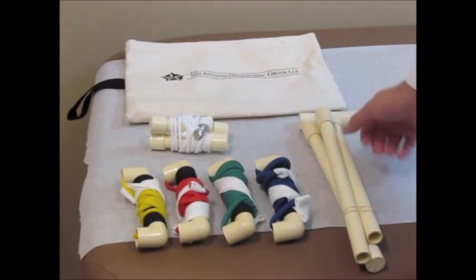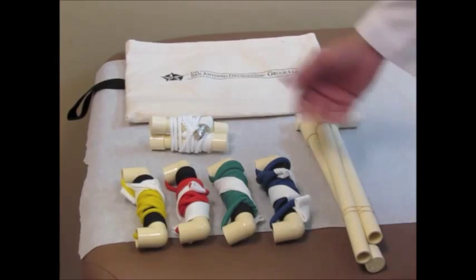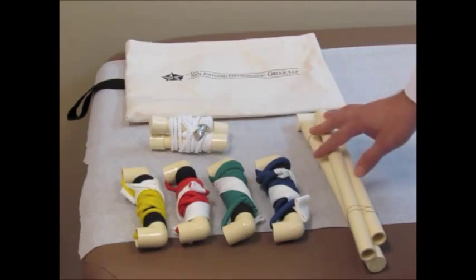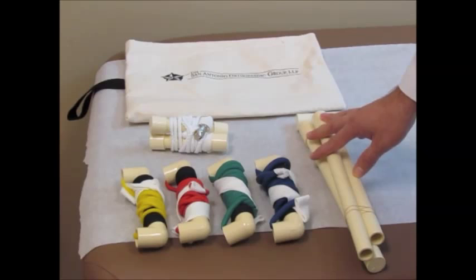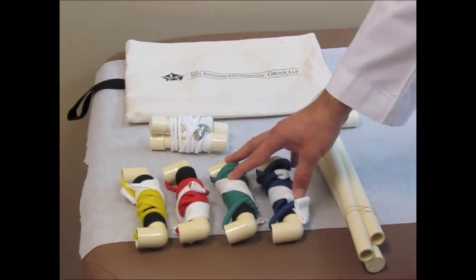Here we have the Physical Therapy Shoulder Kit, most of you will be receiving this. There are six items in the kit — two of these are for passive exercises that you'll be doing early on in your therapy, and these other four are for strengthening exercises that we usually won't introduce until about three months into your rehab.